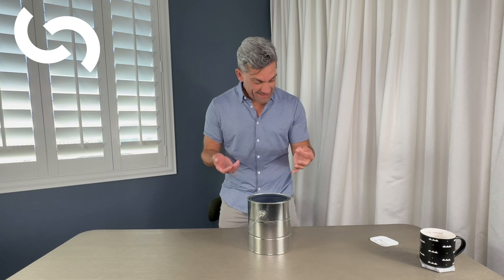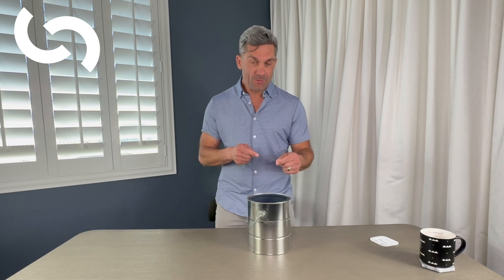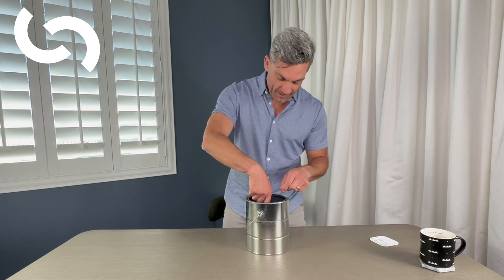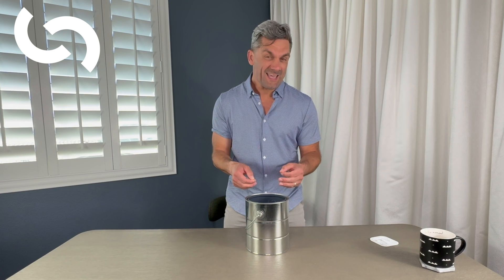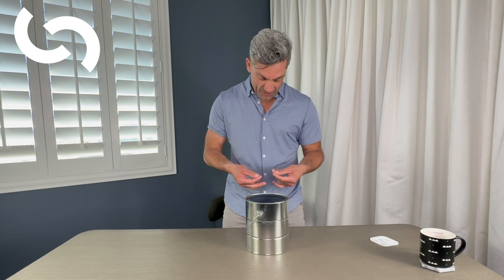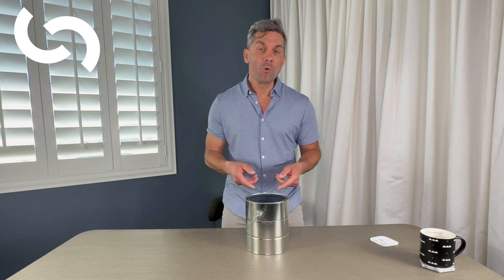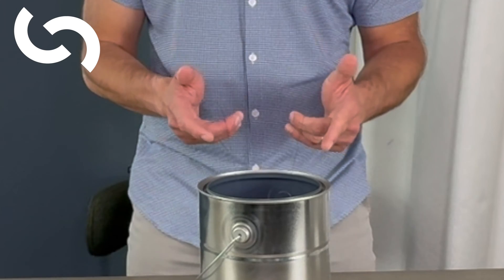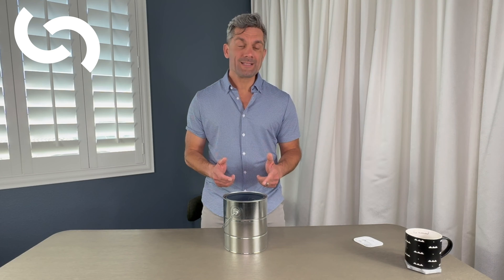So how are we going to tie this knot? Let's say we have a right-angled clamp on a vessel deep in the pelvis and we want to get around that clamp. First thing we do — a little tension with the index finger — and we'll get around that clamp. In our case, it's the hook in the base of the paint can. We want to make sure our suture is even, so we're not stuck with one end deep in the abdomen or pelvis. I like to hold it on my middle finger — that keeps my index finger and thumbs free so I can do two-handed or single-handed knots.